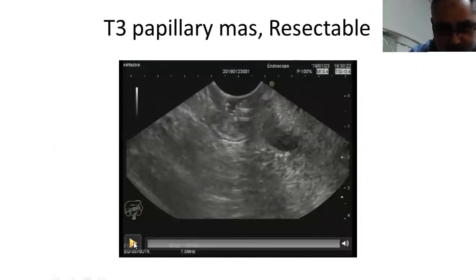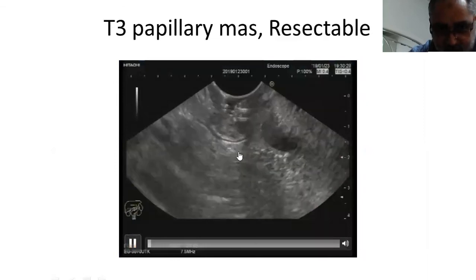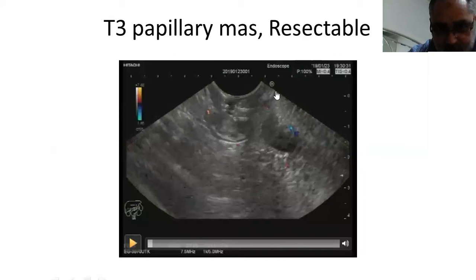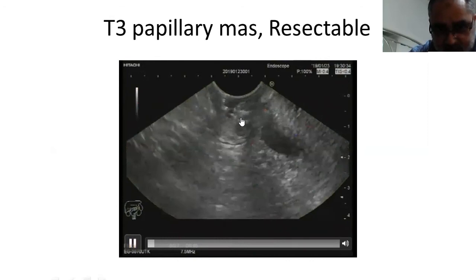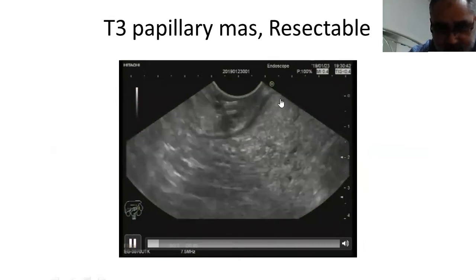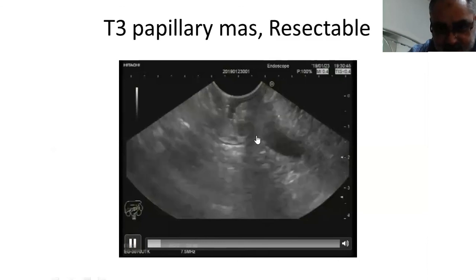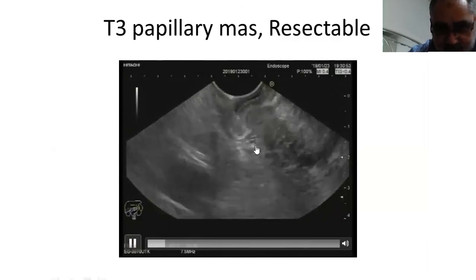This last example shows a T3 papillary mass. This is a papillary mass with a stent inside the lumen of the second part of the duodenum, and here there is interruption of the muscularis propria layer. This is the muscularis propria layer of the opposite wall — well preserved — but at the site of this mass, there is obvious interruption of the muscularis propria layer, and the mass extends into the head of the pancreas. So this is the papillary mass, stent inside the common bile duct, dilated pancreatic duct, interrupted muscularis propria — it is a T3 papillary mass.